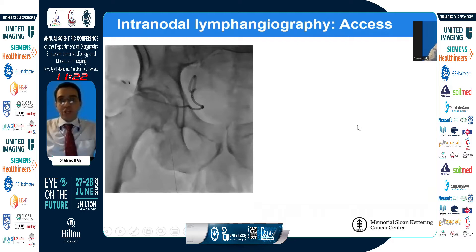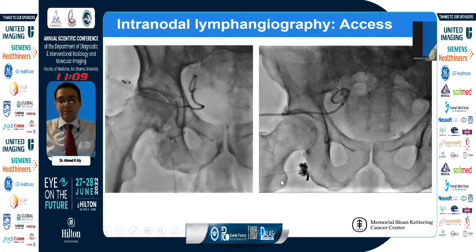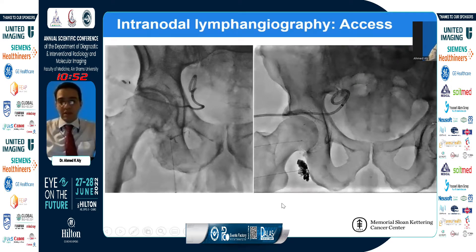Once we start injecting, we monitor under fluoroscopy, looking for linear beaded structures that are the lymphatic vessels. We have to make sure we are not extravasating, because sometimes the needle gets dislocated or we inject too hard. Even if we see the linear structure initially, most of the contrast can go outside the lymph node. When that happens and we cannot reposition the needle, we sometimes choose a totally new lymph node.